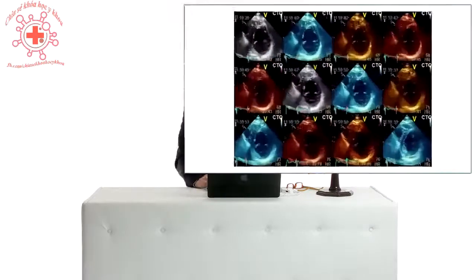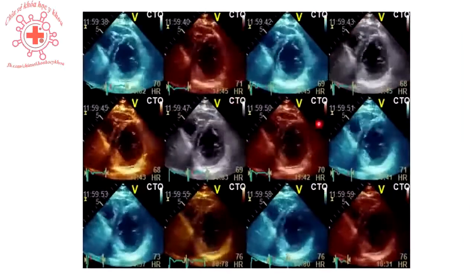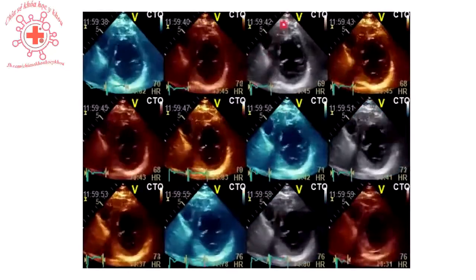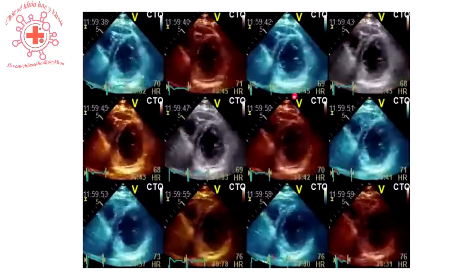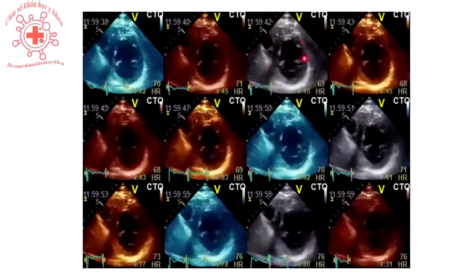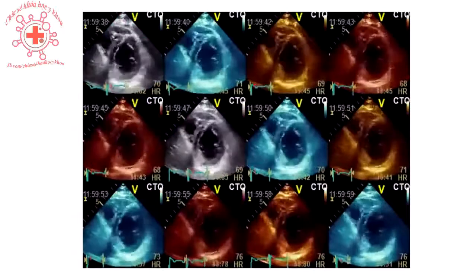If you, however, use a transducer position which is too far caudal, you will also get an oval shape of the ventricle, but in this case, the oval shape will be more in a longitudinal direction. So this is an image that I actually performed for Easter to artificially get Easter eggs with the help of a short axis view that is too far caudal. So here you see the shape of the ventricle looks like an egg, like an Easter egg.